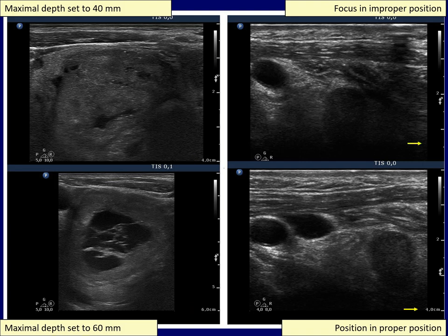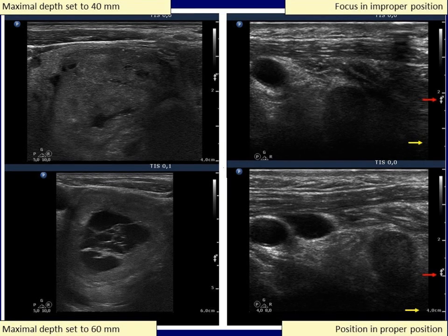The same technique made the dorsal part of the nodule in the right case visible as well. In addition, the focus has also been changed — set from the ventral to the more dorsal part of the nodule.